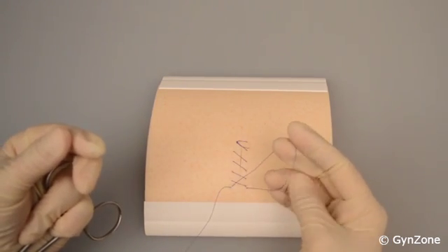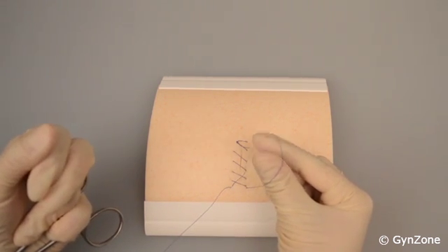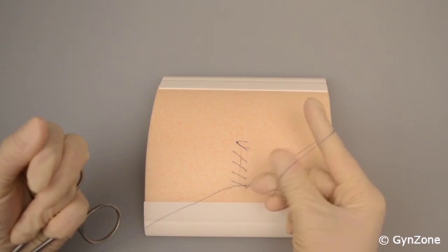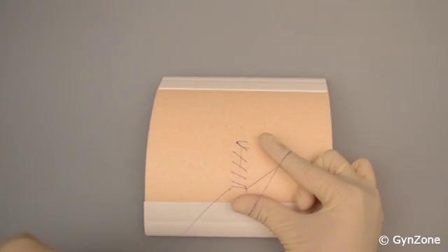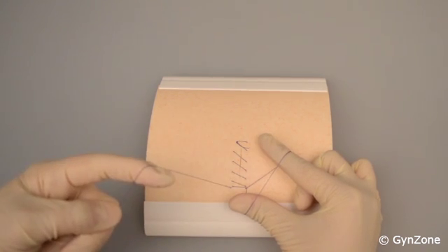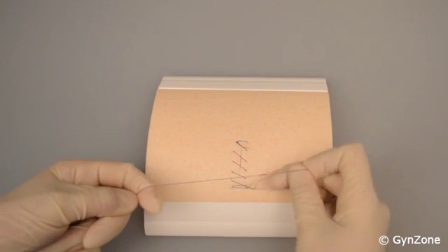Avoid tightening the stitch, instead push the thumb and index finger through the loop formed by the stitch. You can twist the stitch one full round as this makes it easier to make a tight knot. Grip the end of the thread with a precision grip and pull through until you make a new loop.